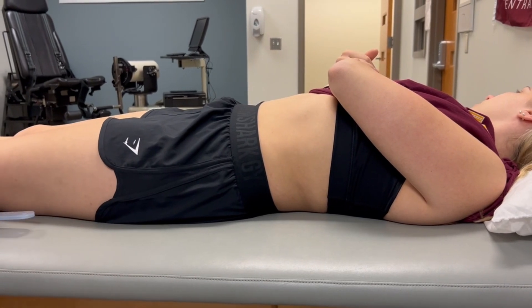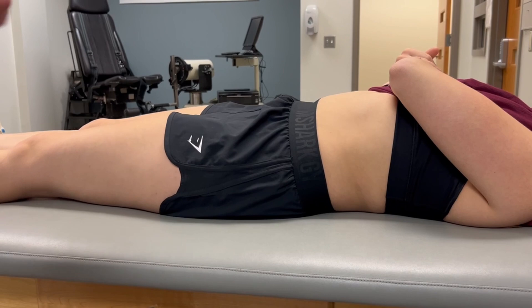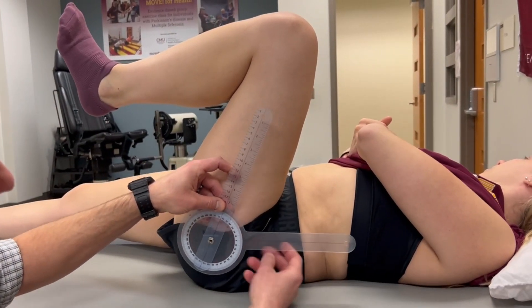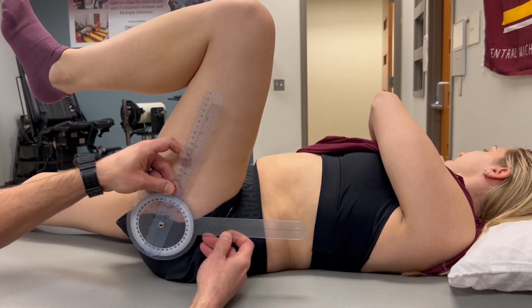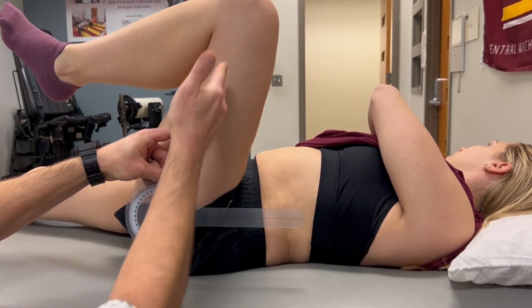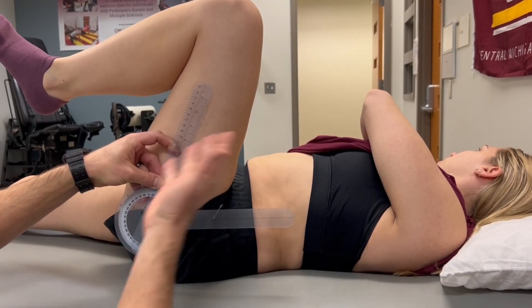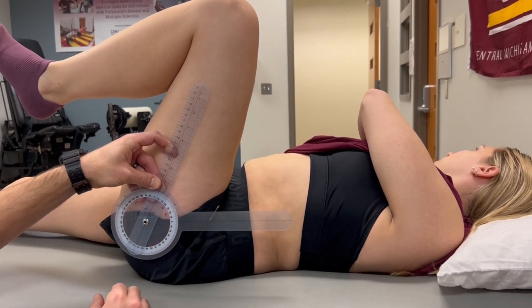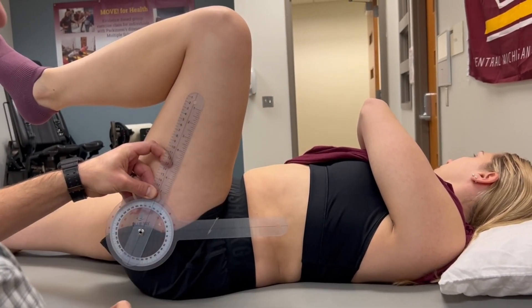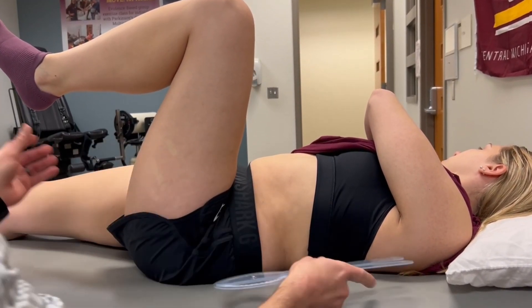Hip flexion, active and passive range of motion. Go ahead and bring your knee up towards your chest. I'm going to use the lateral midline of the trunk and the midline of the femur. If you're having a hard time visualizing the osseous landmarks or the midline of the femur, you can always palpate the lateral femoral epicondyle and use that as a landmark to help with alignment during this hip flexion measurement.